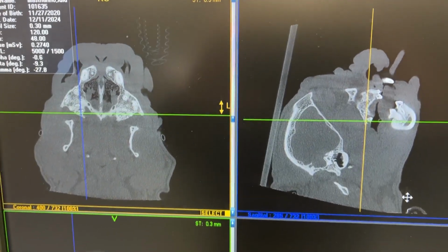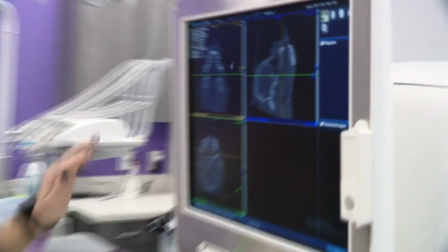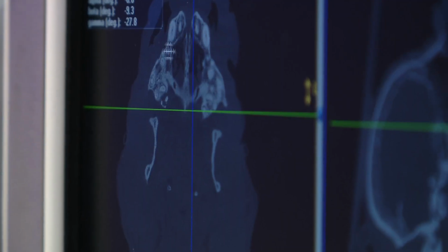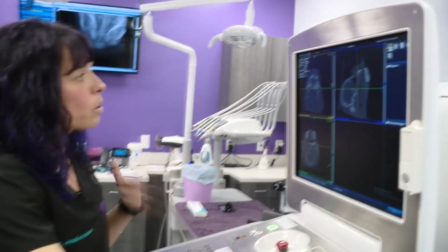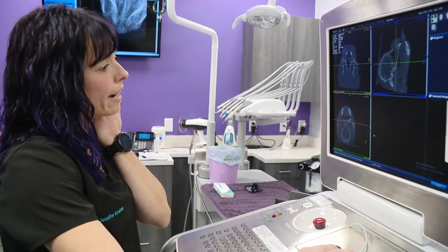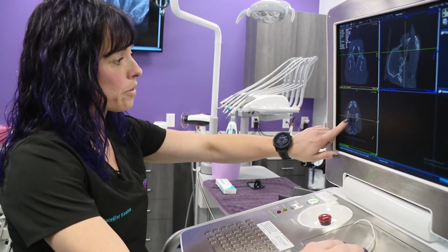So this is a scan of the Frenchie. We've got 3 views here. So we get kind of a top down, so looking from here down through the jaw. Really important here because, like I said, this is all that thick bone that I mentioned. So we can get multiple views through this thick bone. And then this is an image from the nose back, so then we can scan through all of those slices, all of those X-rays that we got from the nose back. We can see the nasal cavity really well.